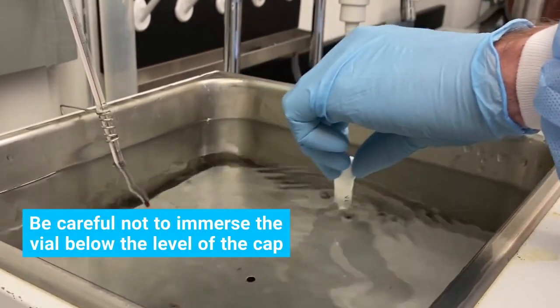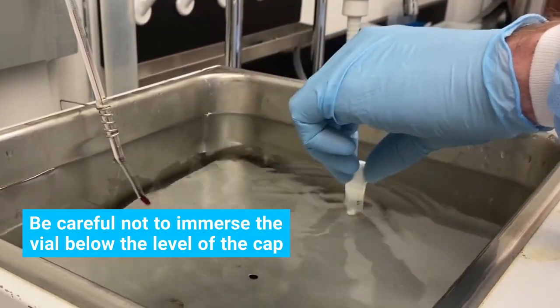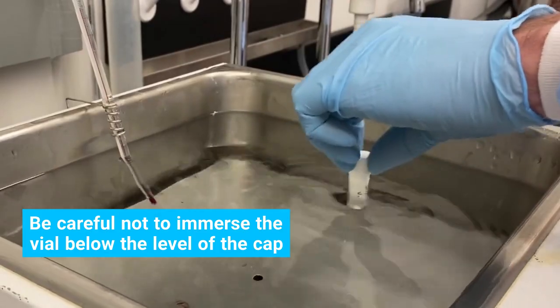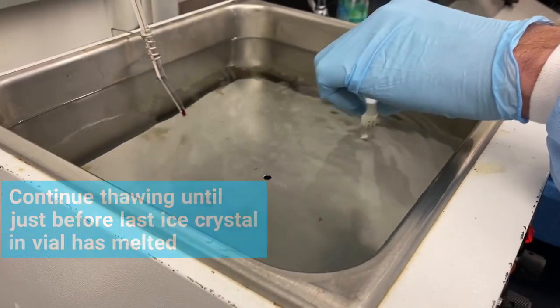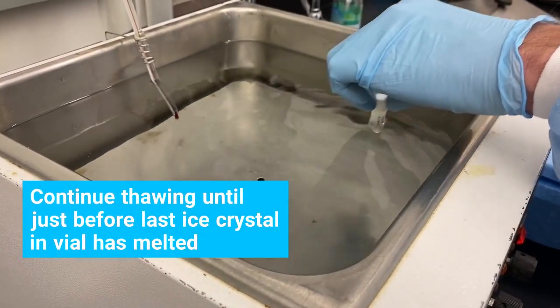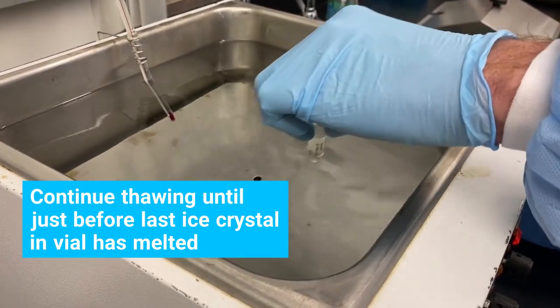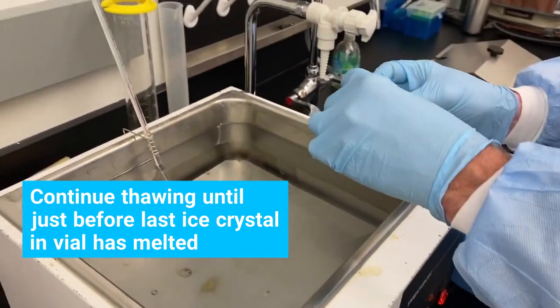Be careful not to immerse the vial below the level of the cap to avoid any potential contamination of the cells. Monitor the vial closely and continue thawing until just before the last ice crystal is melted. Do not vortex the cells.